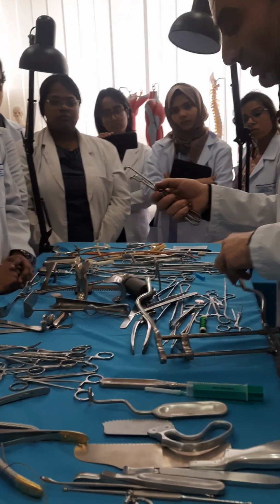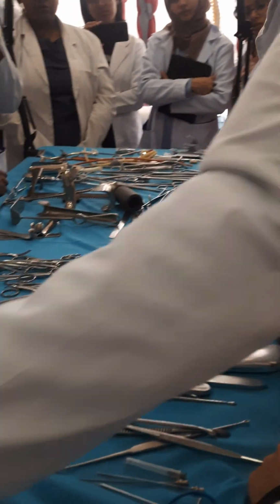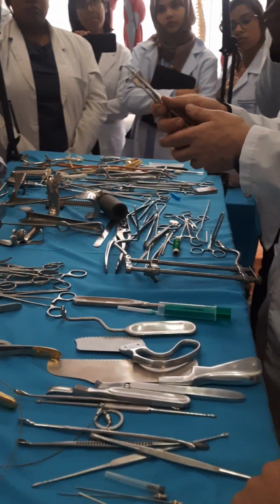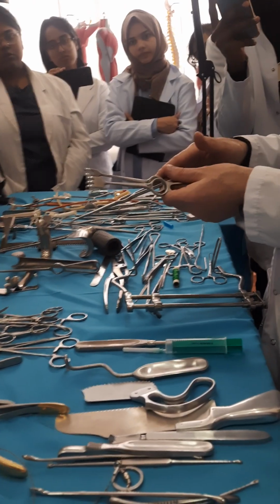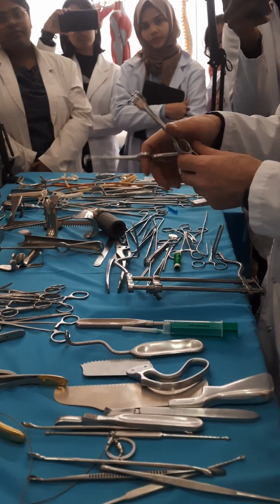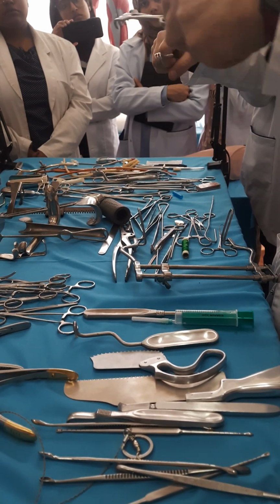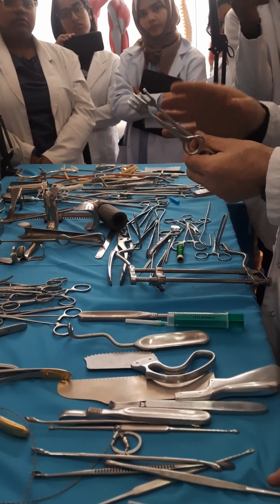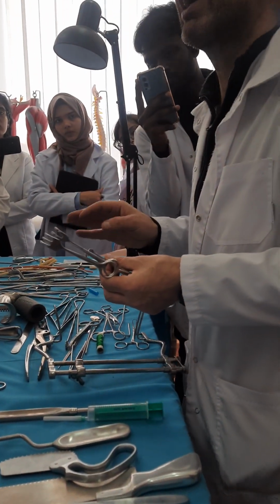This is also retractors. Yeah, we call it the French type or the tooth shape. They can have sharp tips, blunt tips. If you see such kind of design of the handles, this is for your second finger. In that position, you can make the traction. Here, inserting your finger. Very traumatical. Usually skin, fatty tissue, not deeper, or bone fragments.